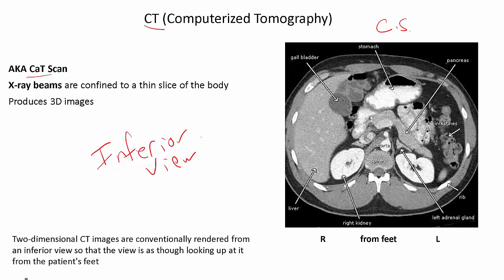And this is important when you're trying to understand the anatomy, you're trying to understand the organ orientation, because you're used to looking at models or at cadavers or at other patients, and you're trying to see, okay, well, how do I get this liver on this side of the body? And remember, the liver's on the right side, and you're thinking, well, there's the stomach right there, and there's the gallbladder. It's like, what the heck? How do you get that view? You would get that view if you were looking upwards at an individual from underneath, right?